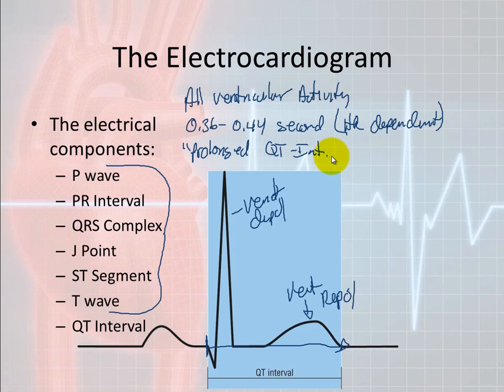So if another beat hits right here in this relative refractoriness, which goes from the top of the T wave down here to the resting period, then it could send the person, theoretically, into a ventricular rhythm, which is a pulseless ventricular rhythm like torsades, VFib, that kind of stuff, pulseless V-tach. So if you have a prolonged QT interval, your relative refractory period also prolongs as well, predisposing the person to life-threatening arrhythmias.